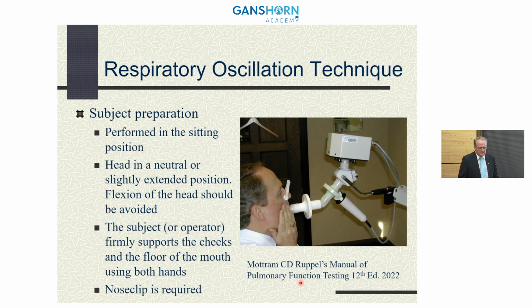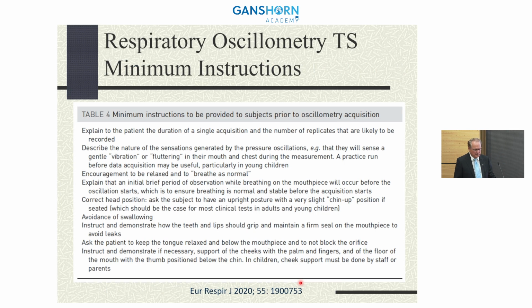As far as the subject themselves, you perform the test in a seated position. Unlike a body box, you don't need to be within a cabinet, but you essentially just need to have the instrument. You hold your head in a neutral position. You do need to have cheek support because the oscillometry device is creating waveforms, and we don't want to have the cheeks be impacted by that.